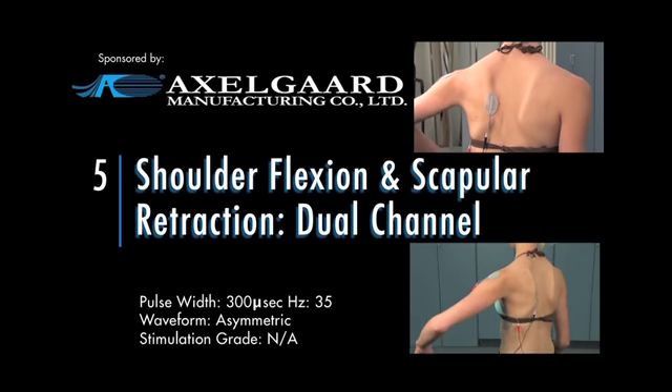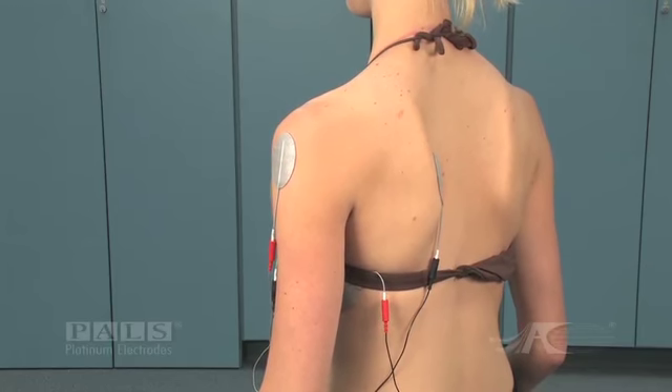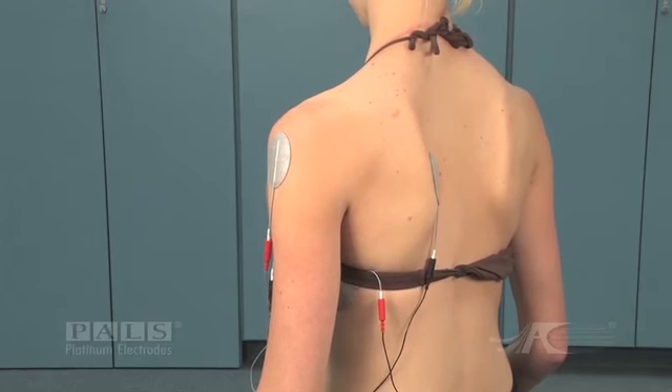Shoulder flexion and scapular retraction dual channel. Electrode placement for shoulder flexion and scapular retraction. Two channels of stimulation will be used.